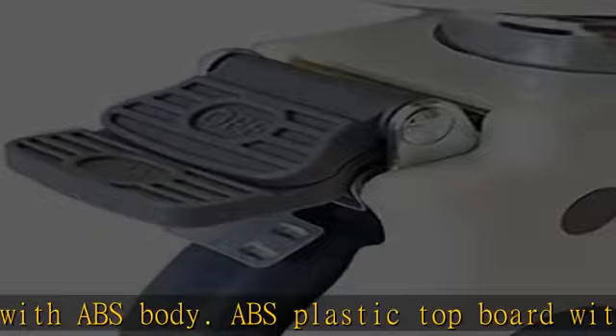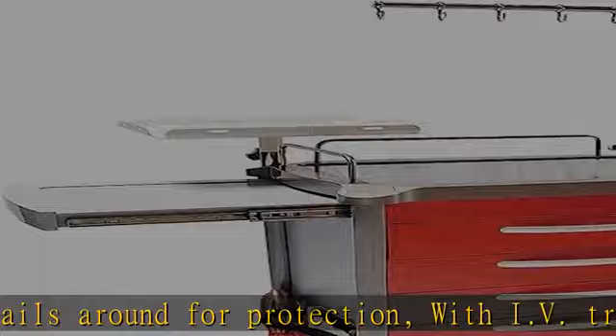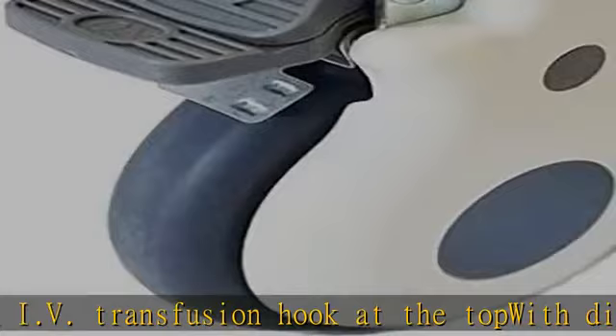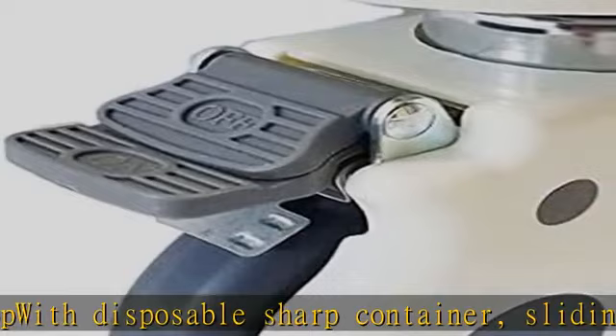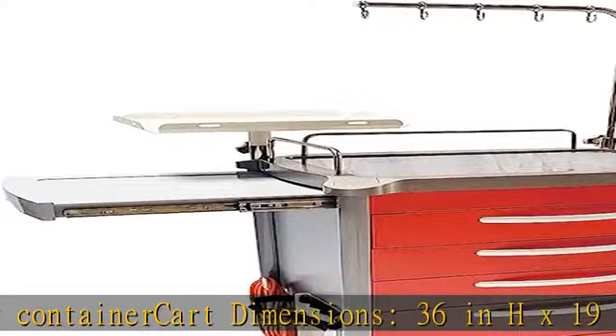Dimensions: 36 in H x 19 in D x 26 in W. Drawer specifications: small 3 in H x 17.5 in D x 21.5 in W, medium 7 in H x 17.5 in D x 21.5 in W, large 10 in H x 17.5 in D x 21.5 in W. Manufacturer warranty: one year. Shipping included, commercial dock to dock. Check the description to get this product today at the best price.